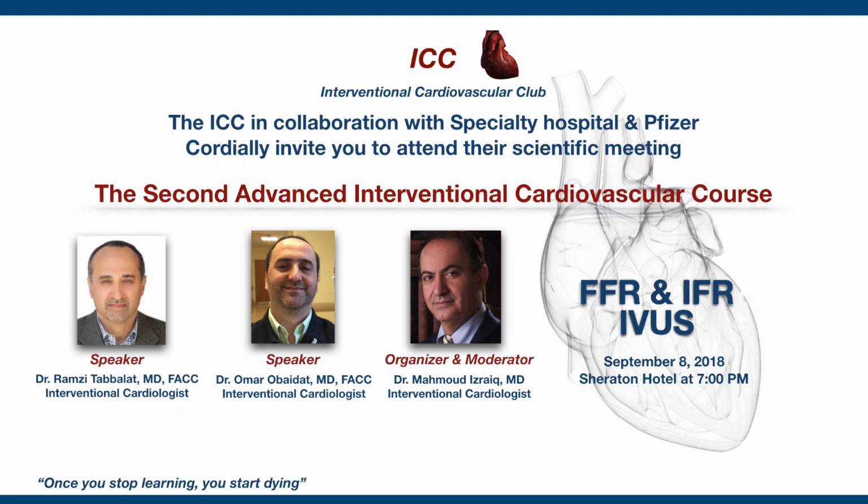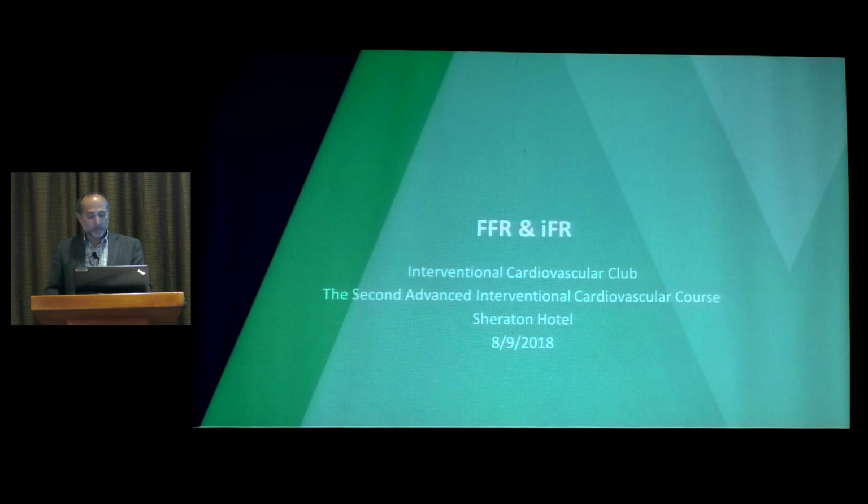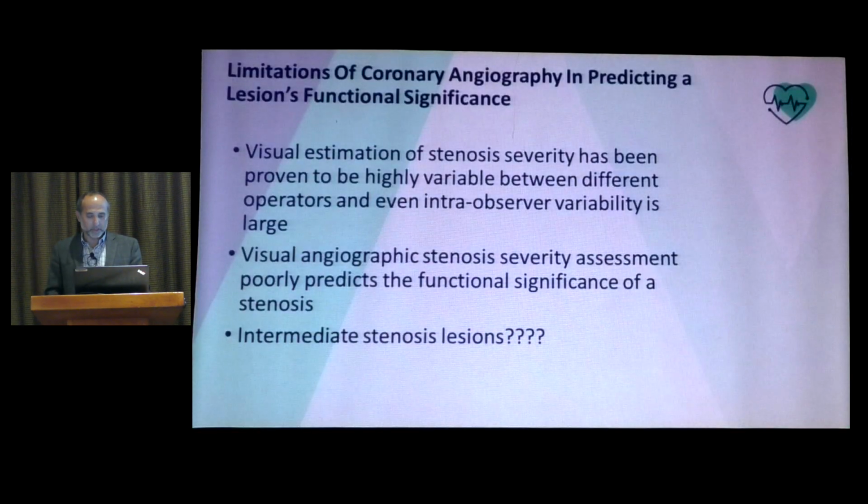Usually, and I'll give you a quick review, in 20 minutes it's impossible to cover the subject of FFR and iFR. But I will do my best to give you basic knowledge, how we apply it in clinical practice in the cath lab to evaluate lesions, and how it compares with other modalities of investigating patients with coronary artery disease when it comes to making a decision in the cath lab whether to leave the patient alone and not to proceed with stenting, because that's an extremely important decision.